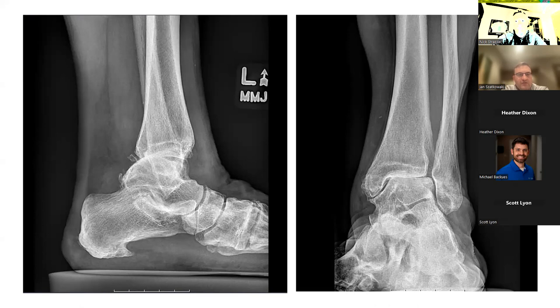The one concern I have is how the talus is posteriorly subluxed. If you look at the talus dome in reference to the center of the tibia on the lateral view — you can see the talus dome is sitting back a little more than normal. Here's the center on the talus and here's the center on the tibia — you can see some posterior subluxation. She's also got a little bit of a flat foot, some collapse in her arch.